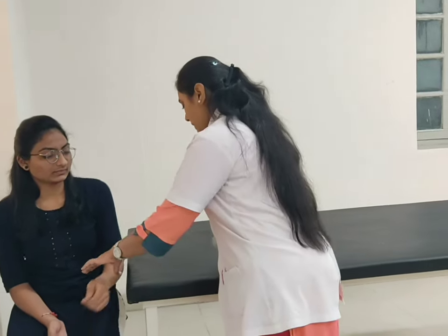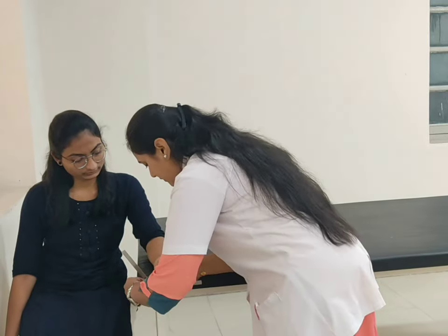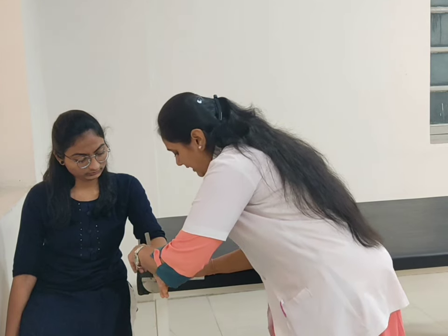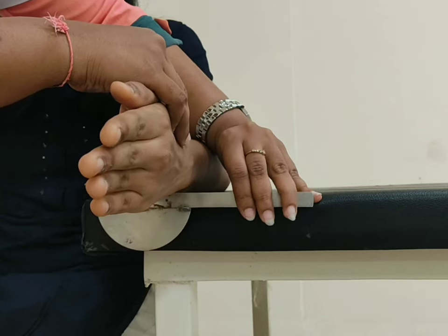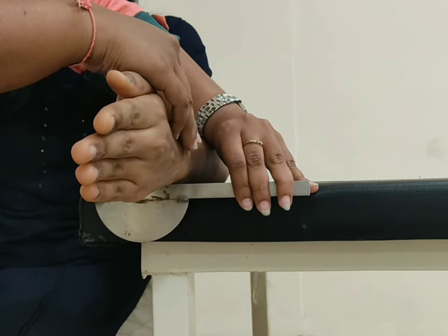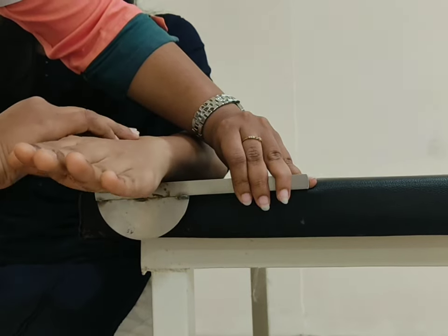For pronation, patient position sitting on a table. Forearm in mid-line position and supported over the table. Fulcrum at the ulnar side. Stable arm parallel to the ground and moveable arm at the anterior aspect of the wrist. Now ask the patient to rotate your forearm so that the palm faces towards the floor. Normal range of pronation is 90 degrees.